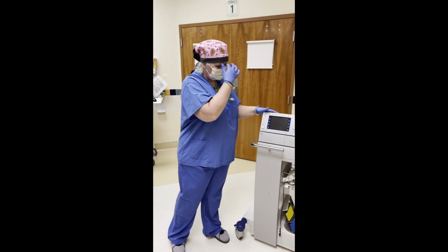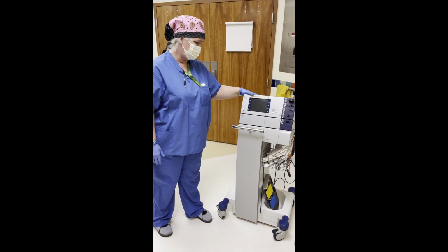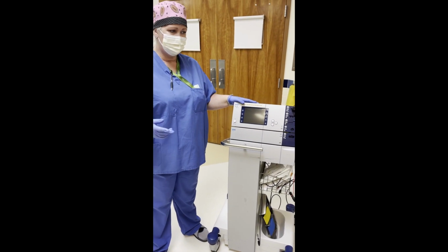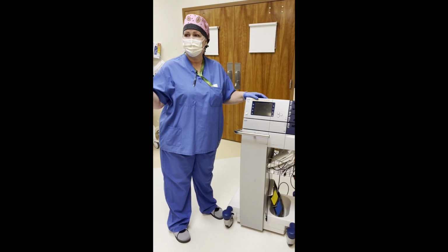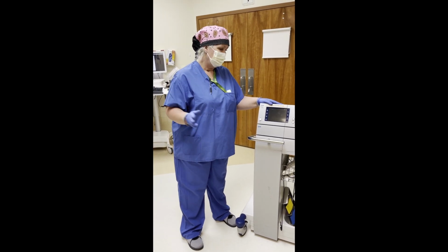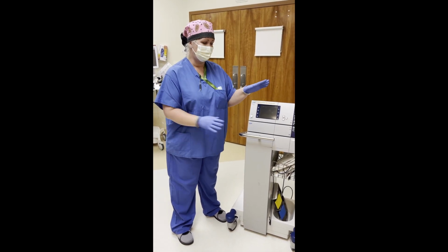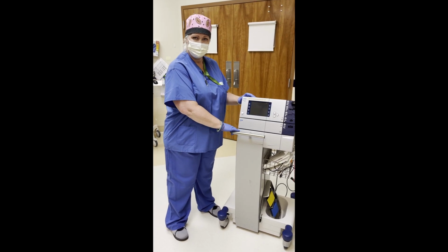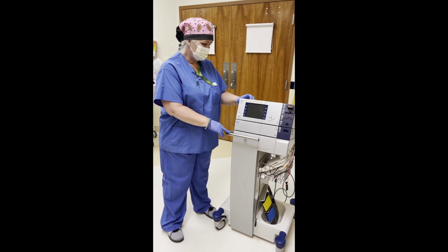All right, so here is the ERBE, E-R-B-E. Okay, it's very specific. Some of the things that we use for cautery, to cauterize bleeds, are a little bit universal. You can plug those into the OR cautery things, huh? Yeah, but you're not going to know which ones those are, so just don't even worry about it. When you get ready to do a procedure, make sure you have the ERBE so you don't have to think about it. Just keep it simple. Do the KISS method: keep it simple, stupid. So anyway, here's your ERBE.